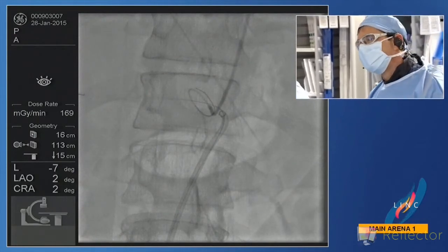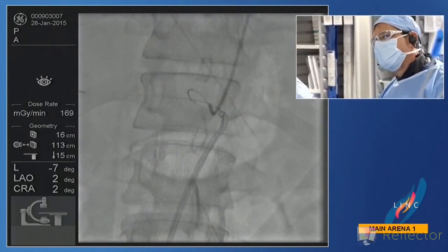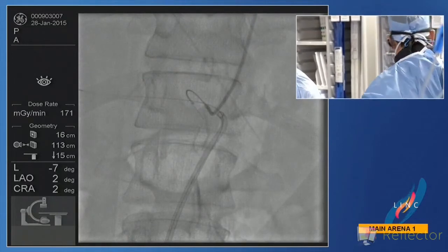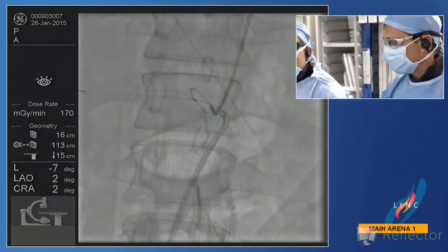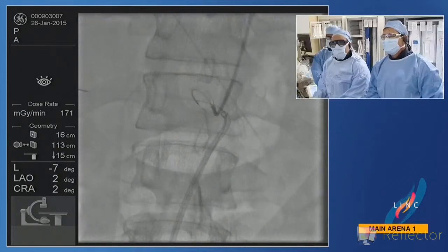I'm prepared, and it'll be a little bit tricky because of the hang-up, to put a Viabahn, a smaller Viabahn, and then more proximally, if we can engage it, put an iCast to sort of bring us up to nominal at the ostium and get the support that we need. So I think that's all really good. We'll see how it goes here, of course. Let's get the tool to make a.